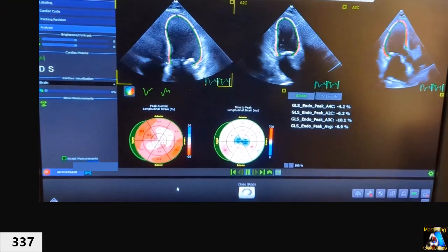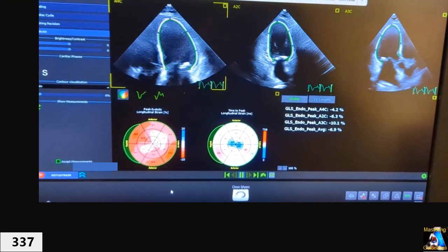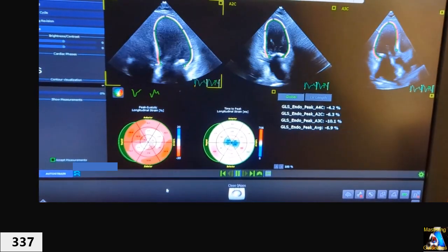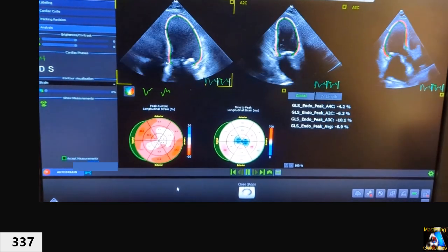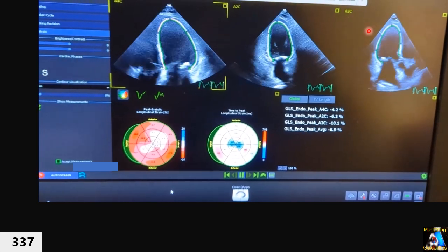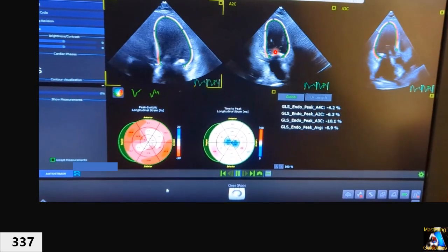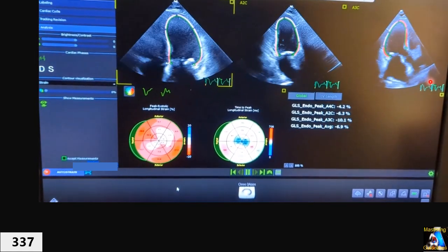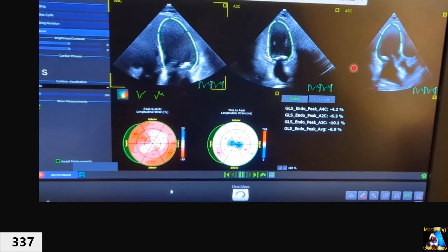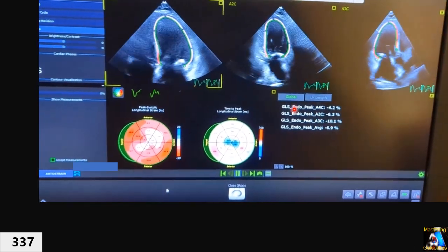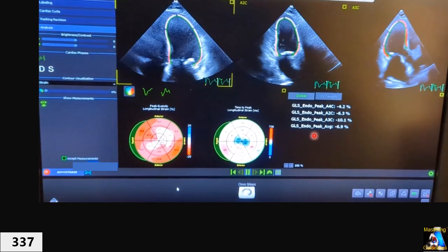After hitting Auto Strain, the machine shows tracing for all three views on the monitor. It labels each view — make sure the labels are correct: apical four, two, three. The results are displayed in a four-box format showing each view and the overall results.